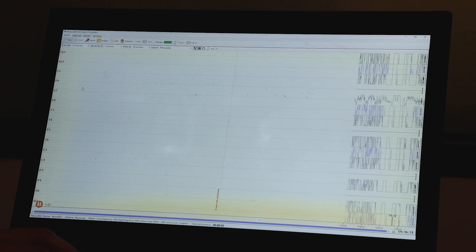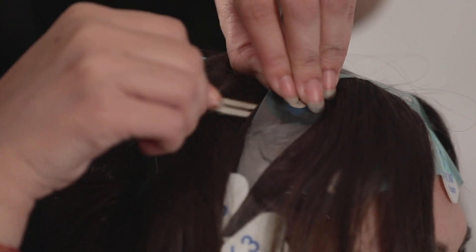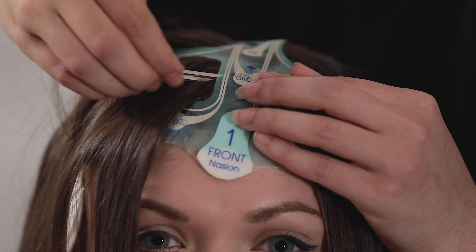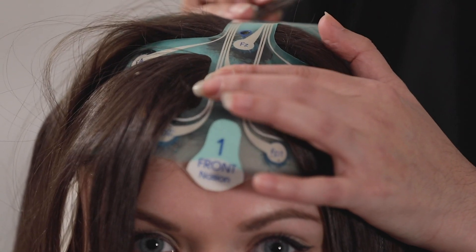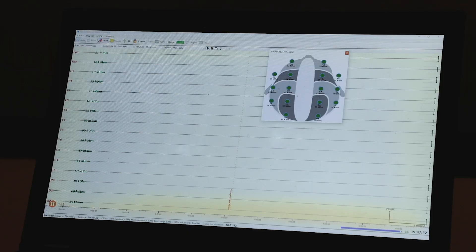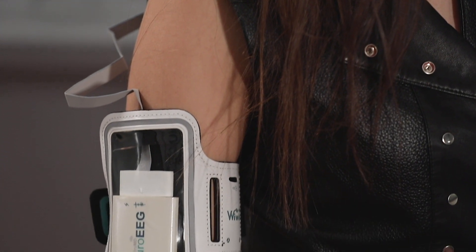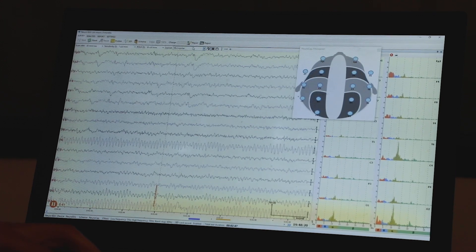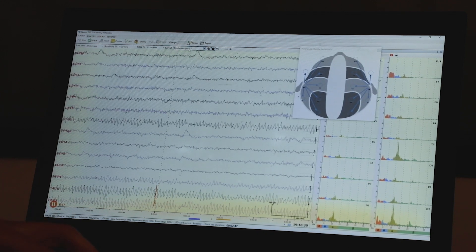Ensure good impedance after starting a test via the NeuroEEG software. Open the calibration tool by pressing the resist button. Troubleshoot any red impedances by using a small hairpin to remove hair under the electrodes, and press down firmly on the sponge electrodes for several seconds to ensure the gel reaches the patient's scalp. Impedances should become green, indicating NeuroCap is properly secured. Once a good connection is secured, reclick resistance, stop the EEG test, reset the data, and begin the actual EEG study recording.